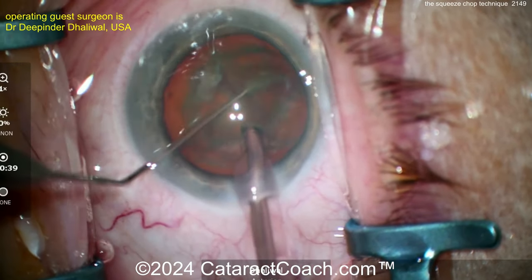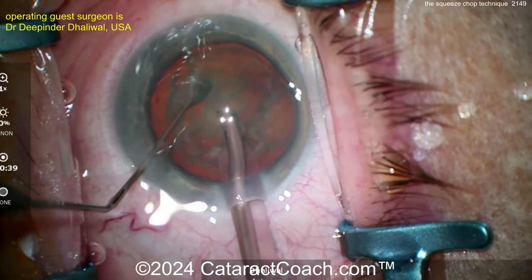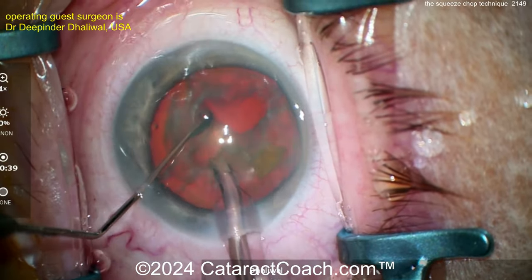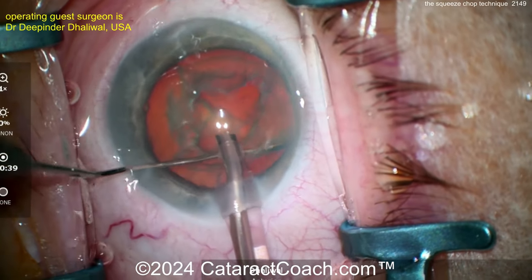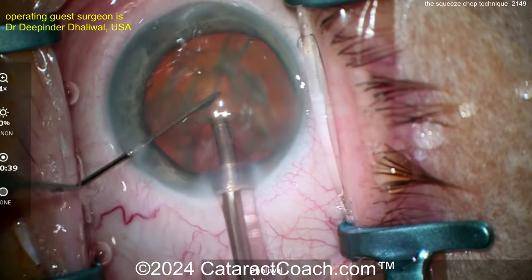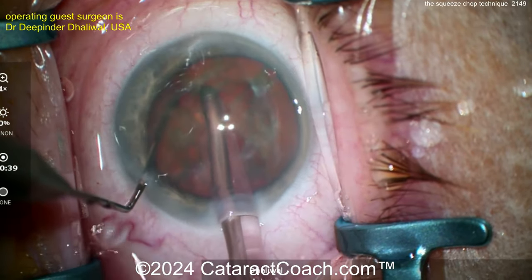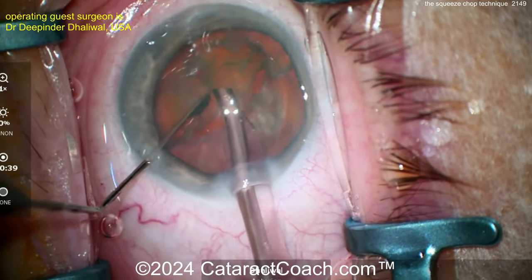The chopper goes around and then just traps the piece between the phaco tip and the second instrument, and then you achieve the chop. Watch again — using that paddle to bring the piece towards the center. If you're having trouble learning phaco chop because of the time constraint, where you buzz into the phaco probe, hold it, then lose vacuum — try this: chopper goes around, trap or squeeze it between the two instruments, and you've achieved the chop.